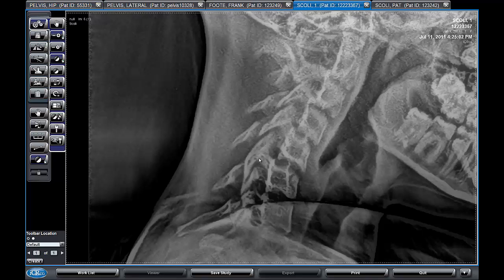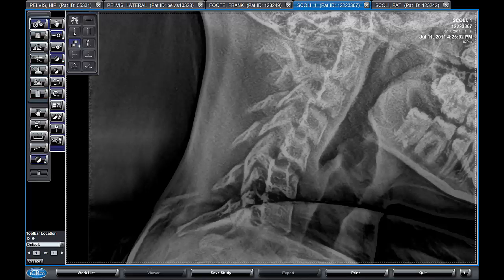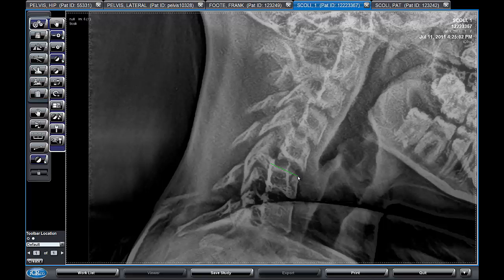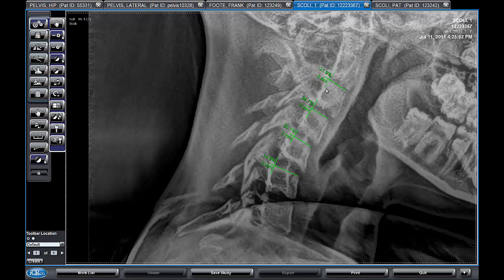We have a tool to measure the alignment of adjacent vertebrae. To use this, we drag a line across the top of the lower vertebrae and then adjust to where it lines up to the one above it. We can drag out several of these fairly quickly. We can also use this tool if the vertebra goes off the back end or the front end — we can measure that as well.